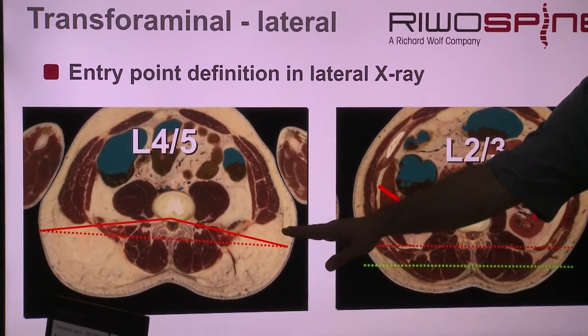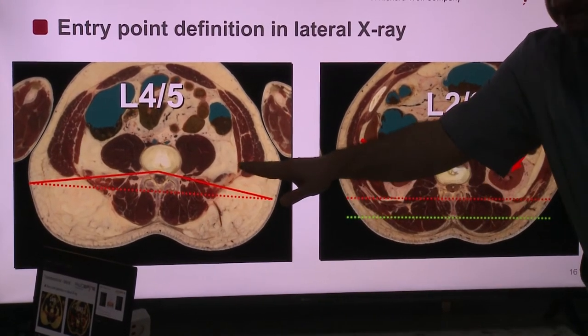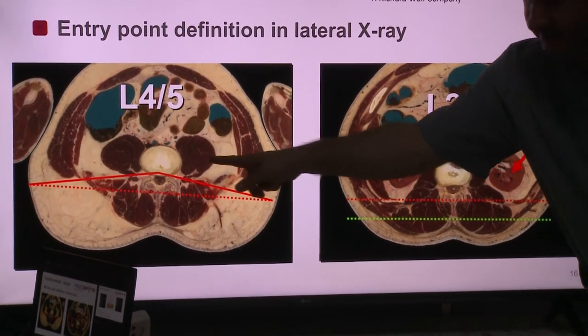What is this? The red line. You shouldn't exit this line. This is the posterior of the facets. You shouldn't go ventral to it because there is the abdomen here.